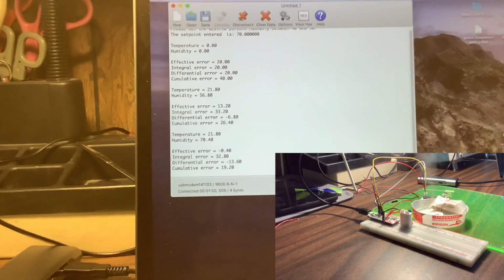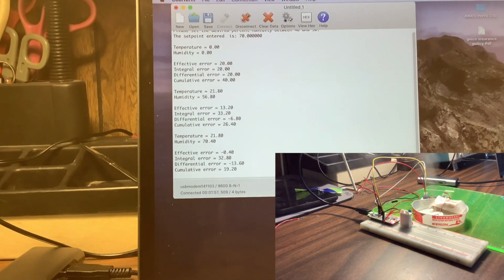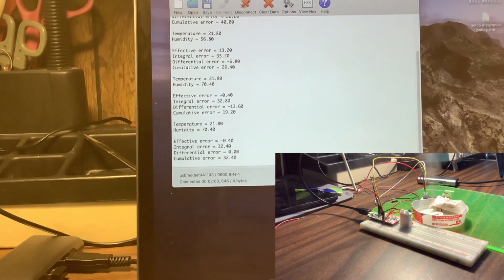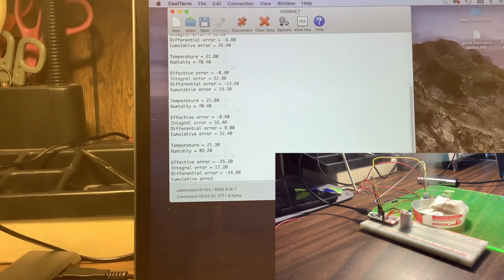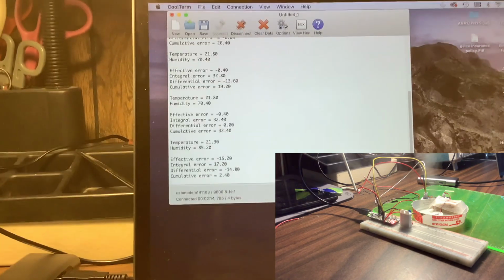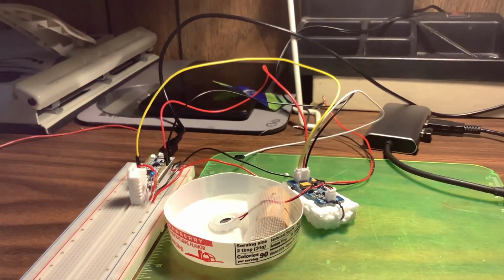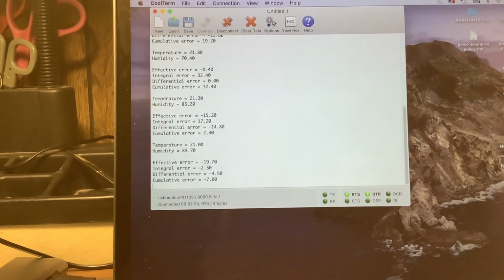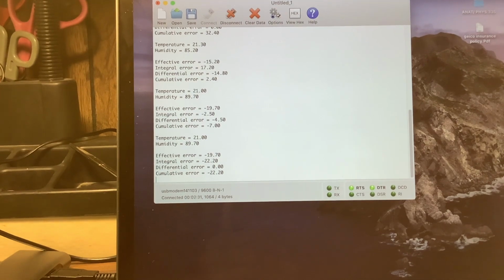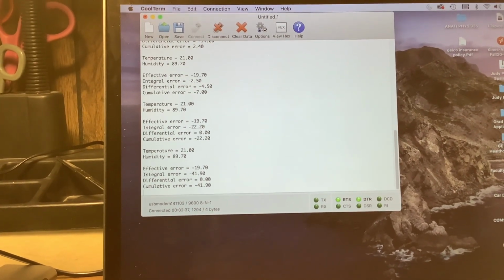And so my system employs PID controller logic, which takes the error values from a proportional error calculation, an integral error calculation, and a differential error calculation, and summates them. And the logic is here basically when the cumulative error becomes negative, we turn off the humidifier. And so we can see that here it crossed over to the negative values, and it's sent to the enable 1-bit controller to turn off the humidifier.